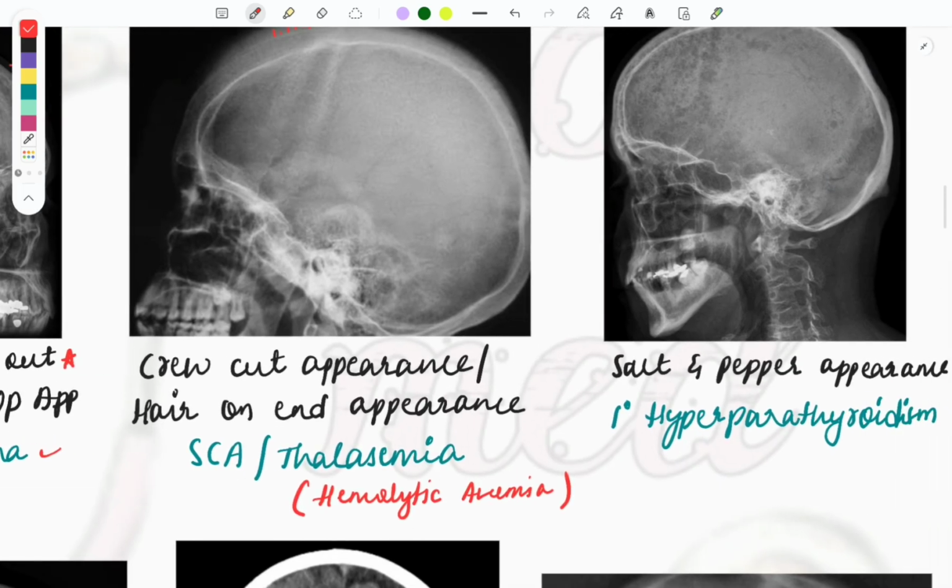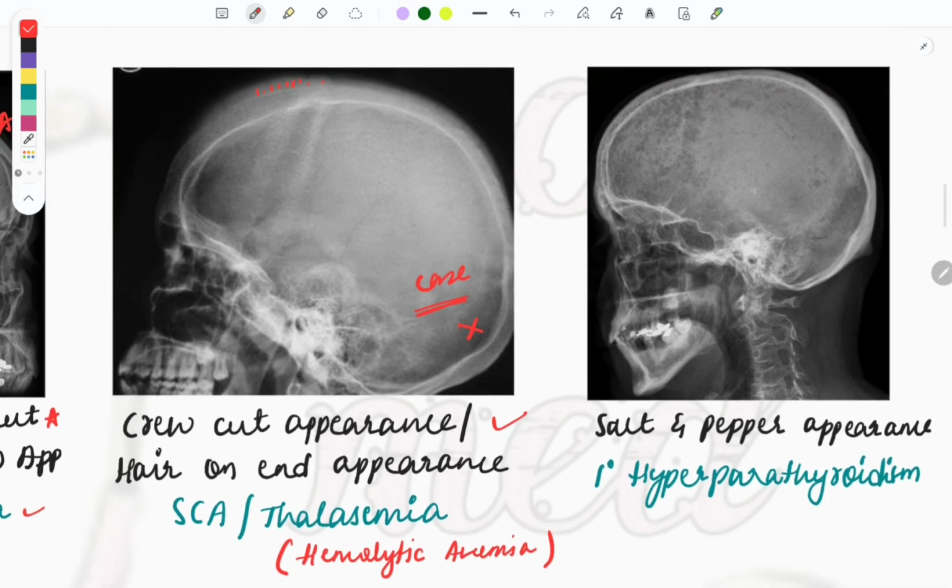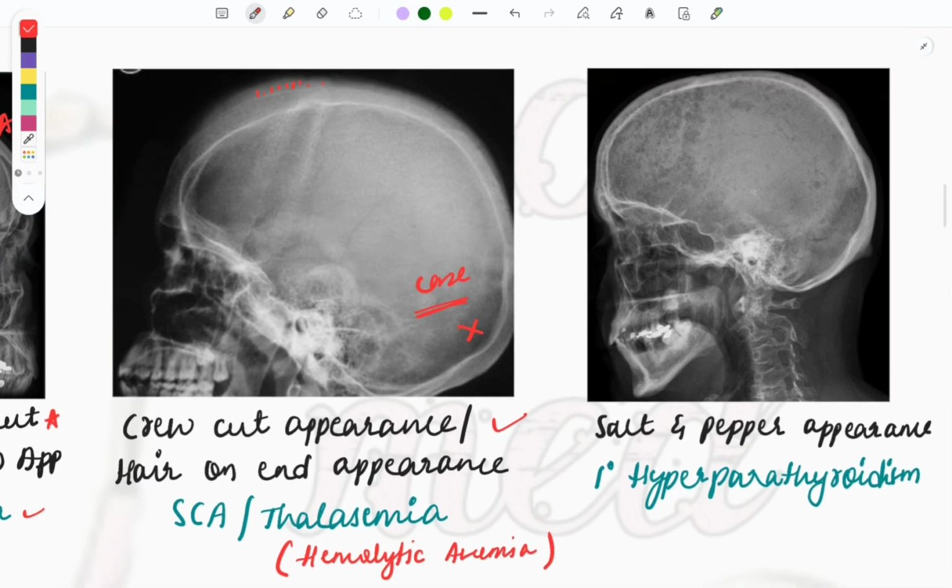A simple one liner can also be asked without giving the image, just giving this appearance, or it can be given in a clinical case, helping you find the correct answer. If not, then a simple image will be given and they can ask what is the diagnosis.